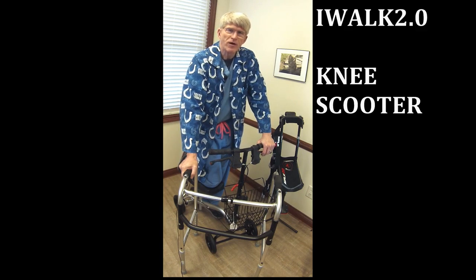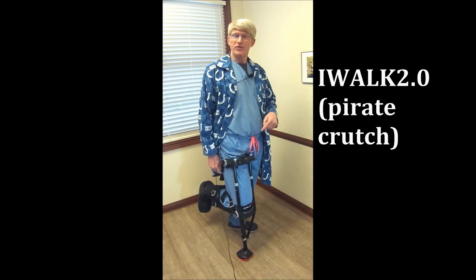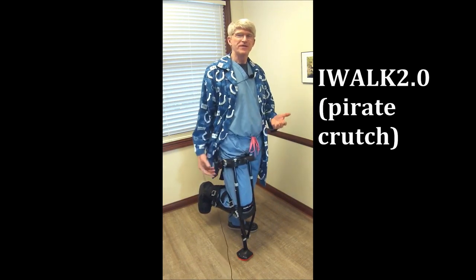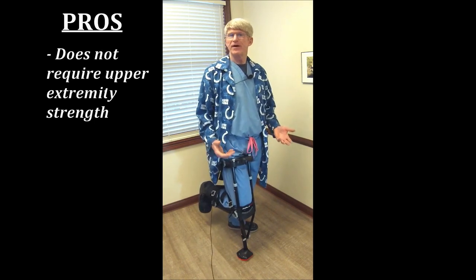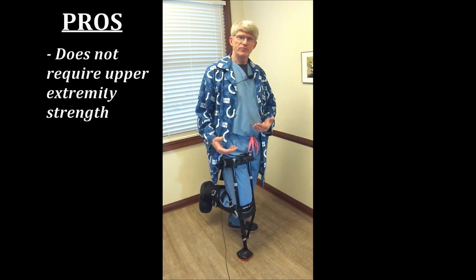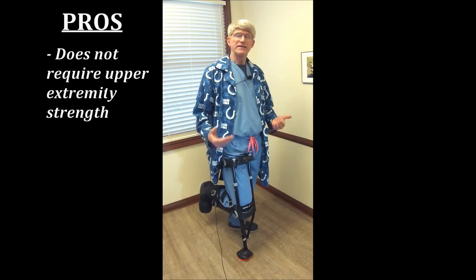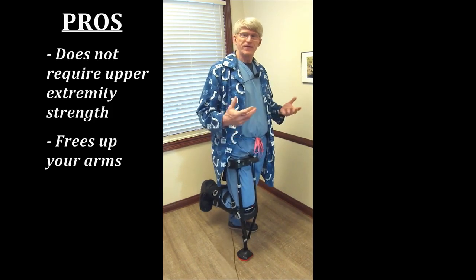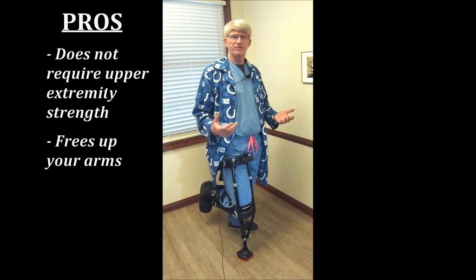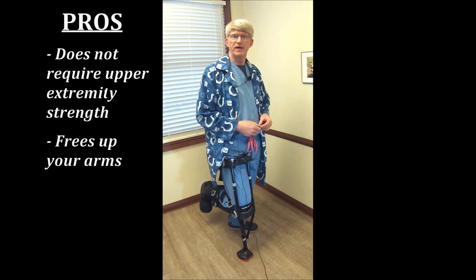Today, we're going to talk about the iWalk 2.0 and the knee scooter. This is the iWalk 2.0, or as I like to call it, the pirate crutch. Now, this will appeal to a certain population, and it really has a big benefit if you have an upper extremity problem. If you have a shoulder problem, elbow, or wrist problem and you can't use crutches or a walker, this might be a good option for you. It also frees up your arms — you can walk around and have free access with your arms, unlike crutches, so you don't have to carry a backpack or a bag.